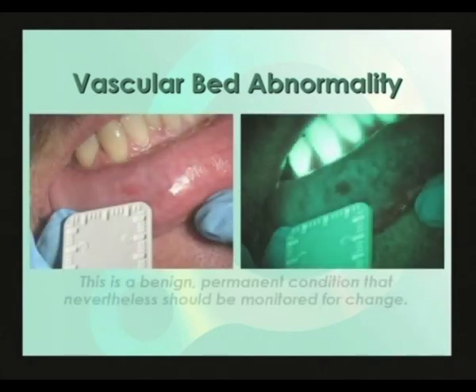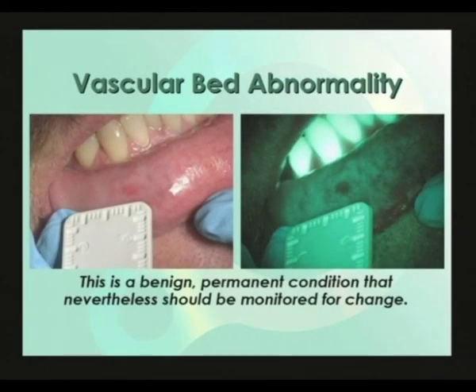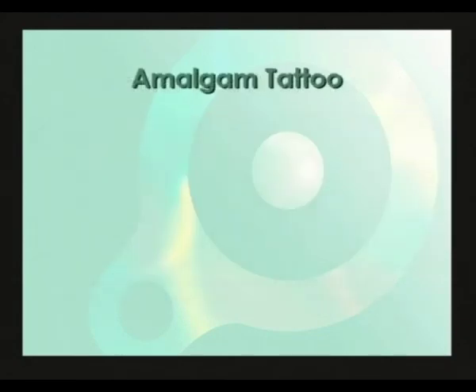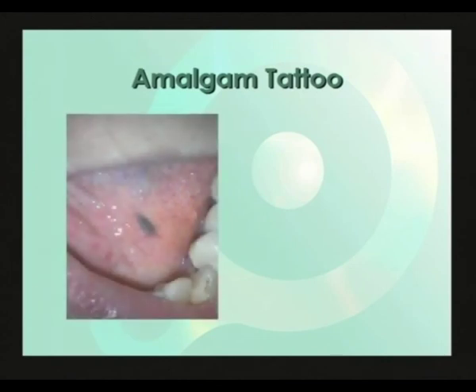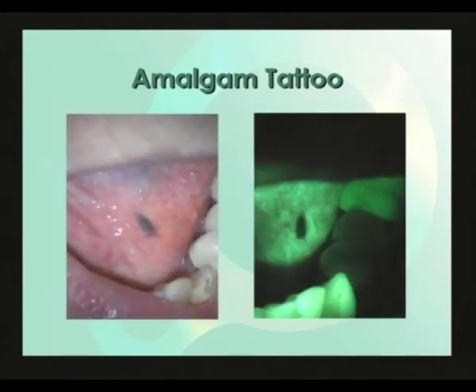Here is an example of permanent dilation of the vascular bed — a benign permanent condition that nevertheless should be monitored for change. This is an amalgam tattoo, which shows up as dark in white light just as it shows up dark under VELscope due to light absorption. The presence of filled teeth nearby would help confirm the identification of this particular lesion as an amalgam tattoo.